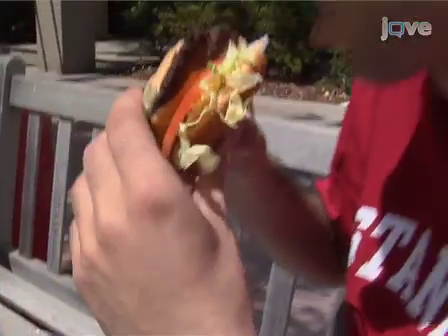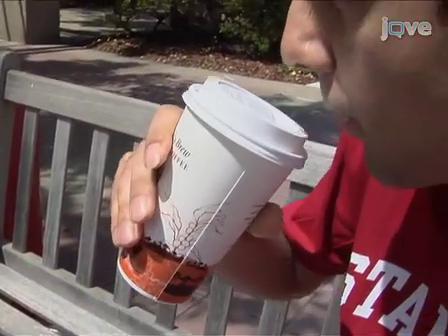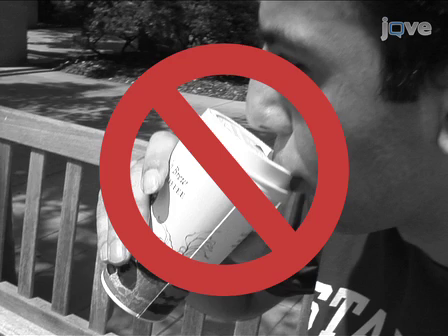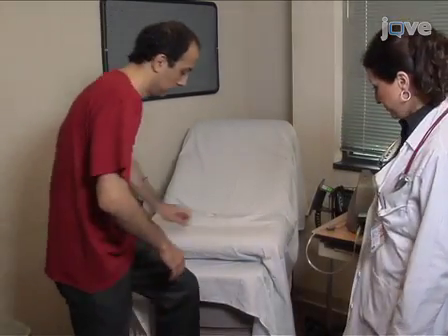Prior to beginning the study, the patient needs to fast for at least 4 hours and also abstain from caffeine, tobacco, vitamins, or any medications that may affect vascular tone during the study for at least 8 hours. The patient should wear loose-fitting clothes and be free of jewelry on the upper extremities. With respect to location, the study should be conducted in a quiet, dimly lit, temperature-controlled exam room.